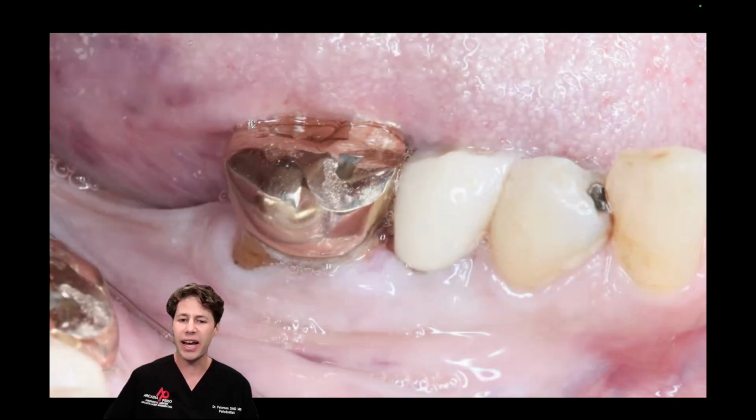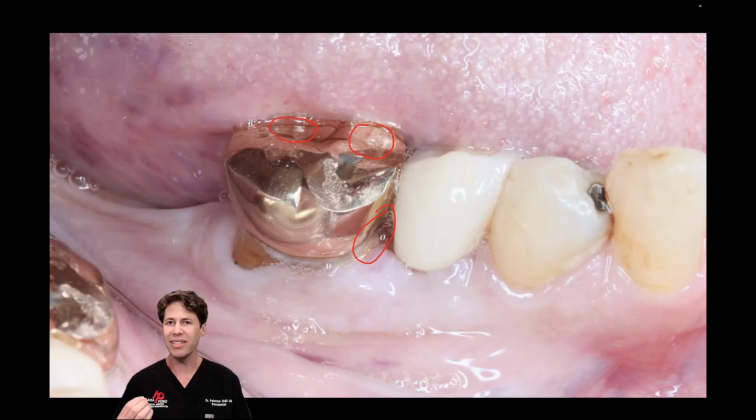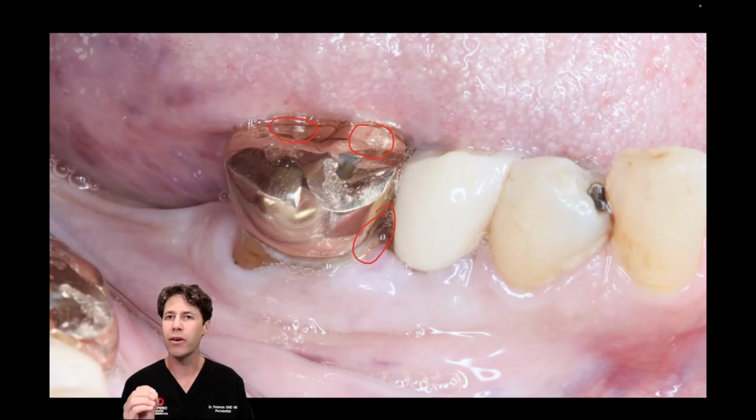So you can see the advanced caries on the mesial aspect of number 30. You have pretty heavy wear facets, especially these non-working wear facets on the lingual cusps of tooth number 30. Adequate band of keratinized tissue, some localized recession. So let's talk about incision design on this. Do we flap this? Do we not? Are we going to try and get primary closure around this case? Are we going to place a healing abutment? Are we going to place a cover screw? All very good questions that will be answered.